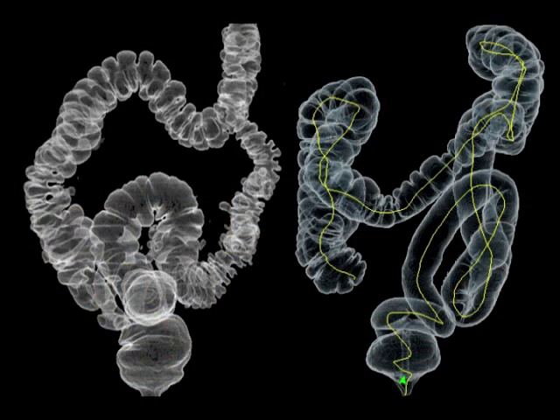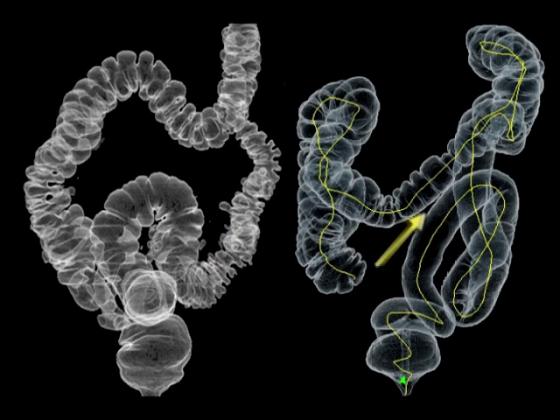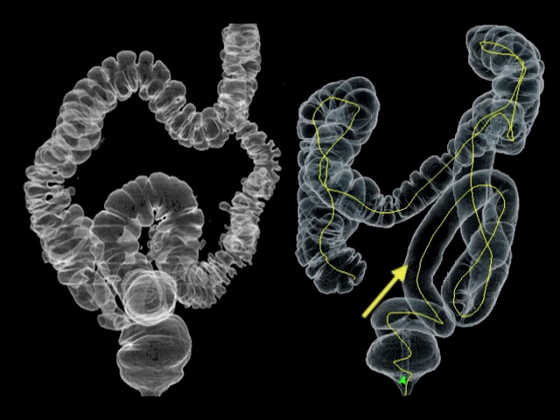We can see differences between patient A and patient B. We can see how wrinkled and how many protuberances are in the sigmoid colon of patient A. Whereas with patient B, the colon is a lot smoother. This patient has constipation and diverticuli of the colon, while this patient has diarrhea where the mucosa has been smoothed out.